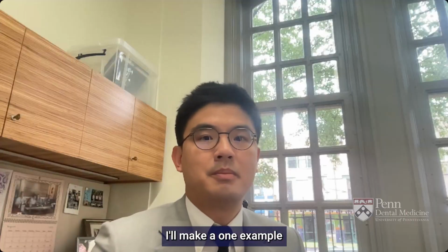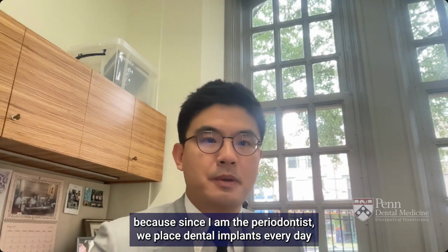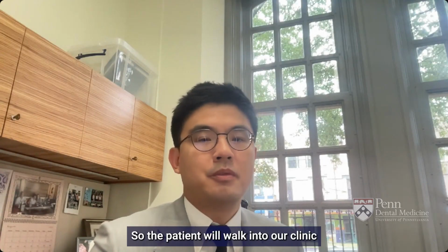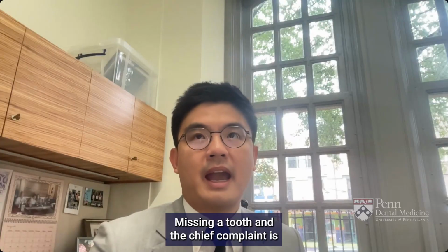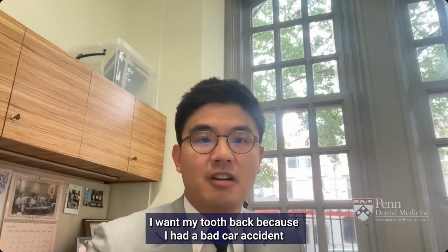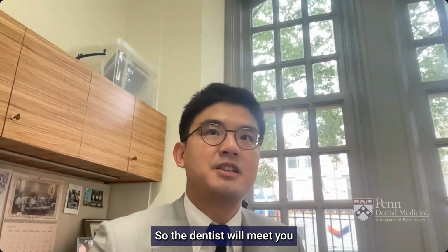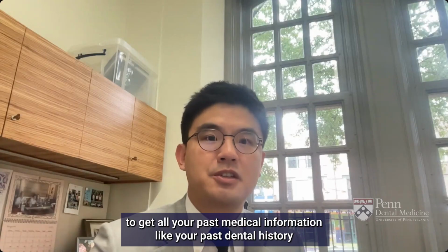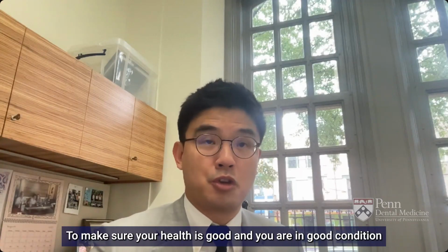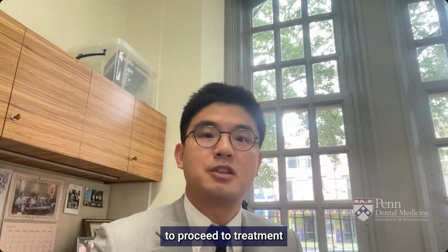I'll give one example, since I am a periodontist and we place dental implants every day. So the patient will walk into our clinic. They're missing a tooth, and the chief complaint is, I want the tooth back because I had a bad car accident. So at that visit, the dentist will first greet you and get all the medical information, like your past dental history, to make sure your health is in good condition to proceed with the treatment.